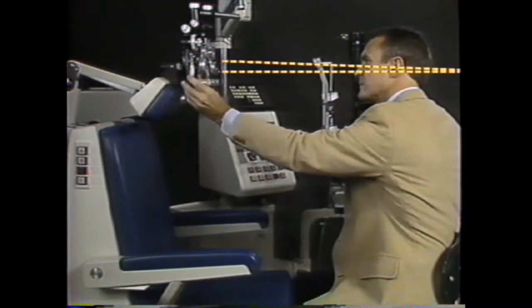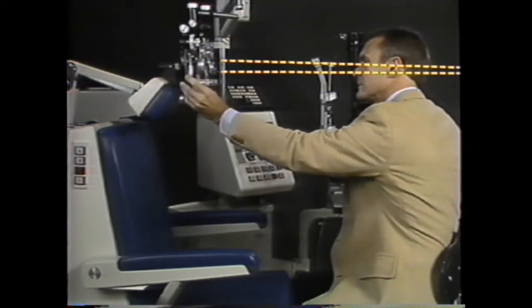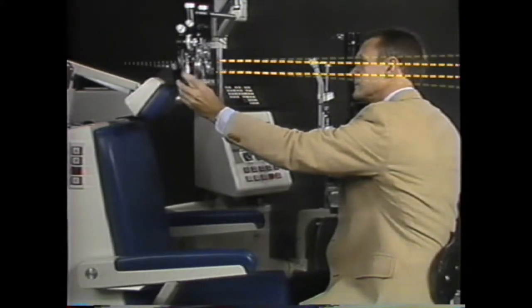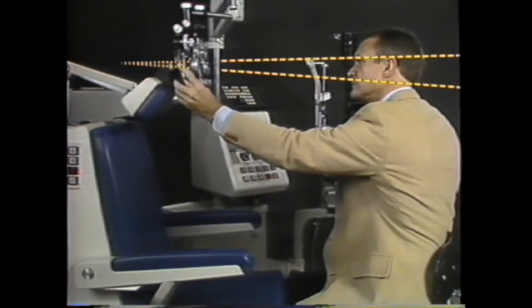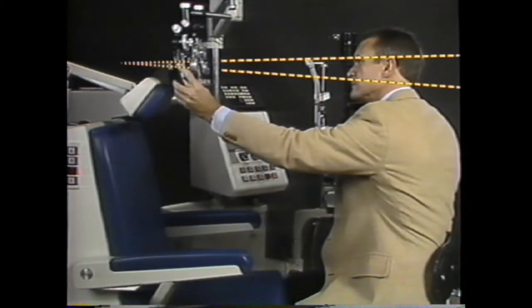The far point can be moved beyond the retinoscope to infinity, and even beyond infinity by continuing to dial up on the phoropter. The far point beyond infinity is actually a virtual far point behind the eye.